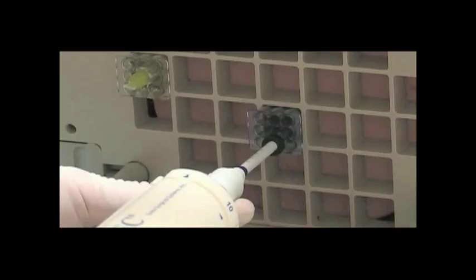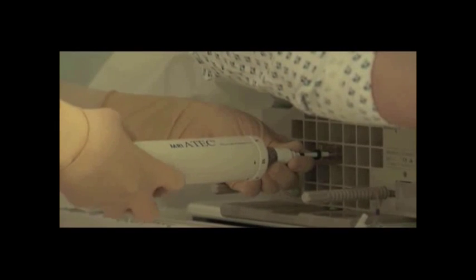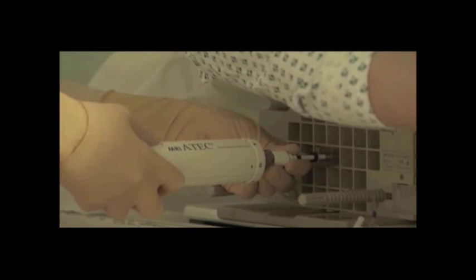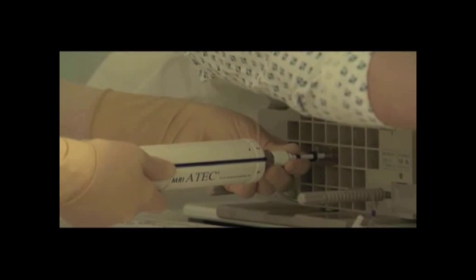With this surface facing up, your needle will be at the 12 o'clock position. Core samples can be taken at any clock position depending on the location of the area of interest.